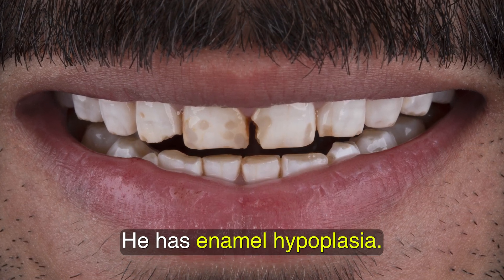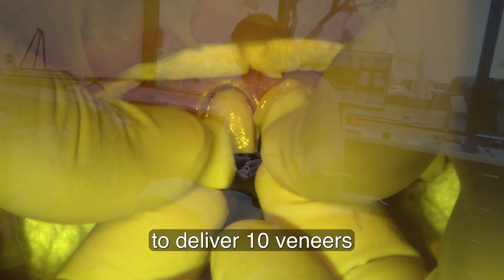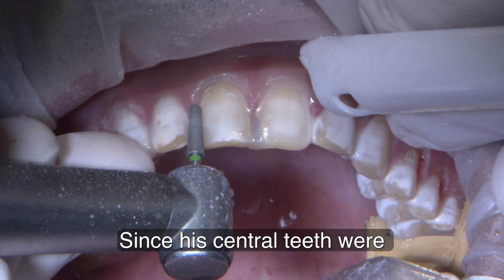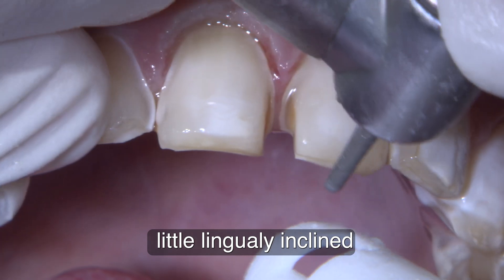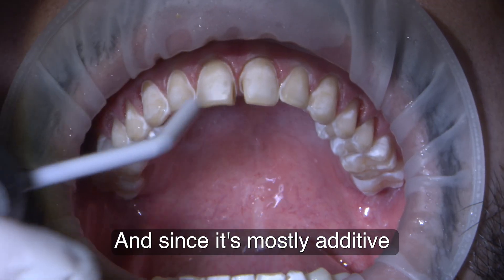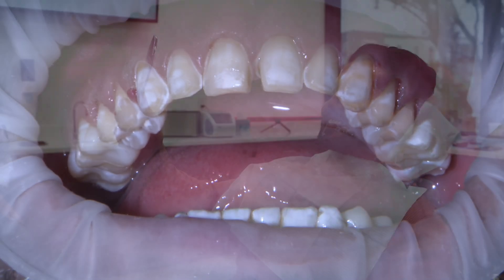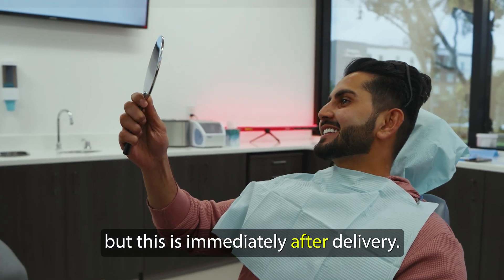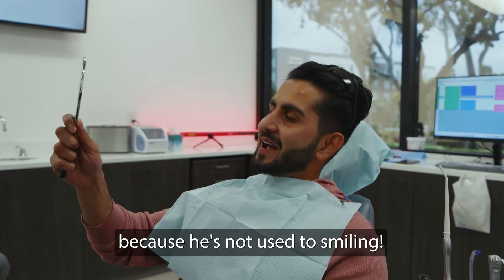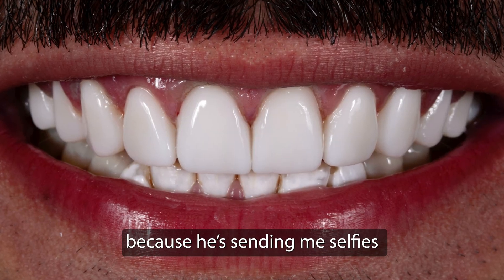He has enamel hypoplasia. The plan for him is to deliver 10 veneers all in the same day. Since his centrals were a little lingually inclined, I don't prep too much away. And since it's mostly additive on the incisal, I don't take much away off the incisal either. But this is immediately after delivery — he was so taken aback because he's not used to smiling. I think I created a monster because he's sending me selfies almost every day.